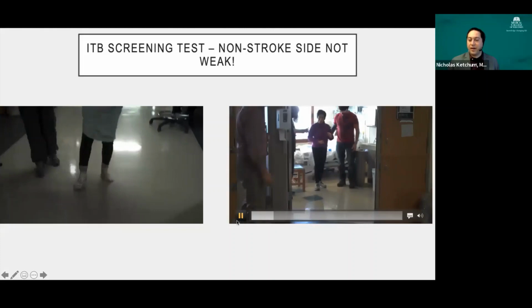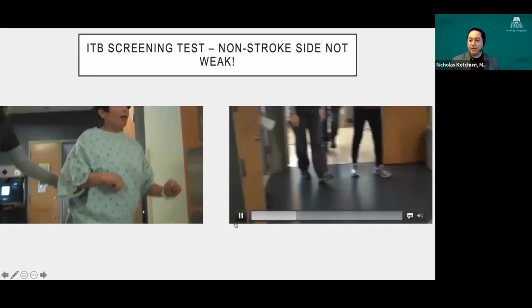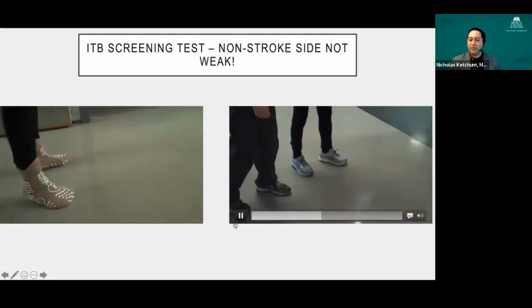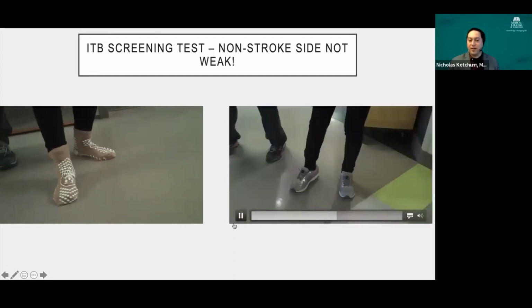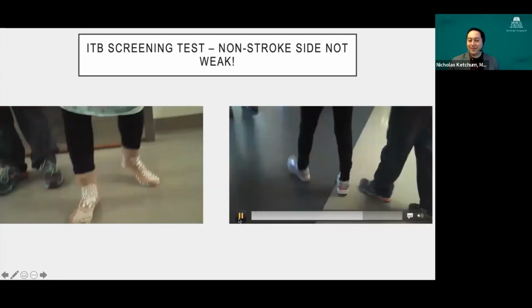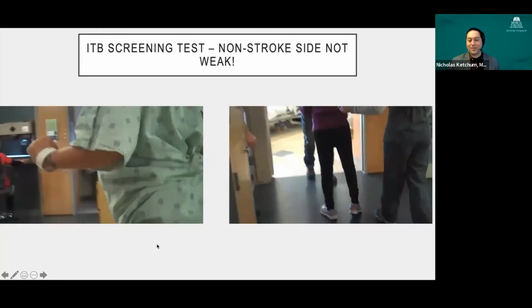her left side is not weak, and her step length is a little longer. She's able to bear weight better on that right side. She's not perfect, but much more ease of movement. She's still excessively plantar flexed on the right side, but that transition is much easier in terms of turning once the baclofen was working. And so she actually went ahead to get the pump, and I just saw her a few weeks ago, and she's doing great.